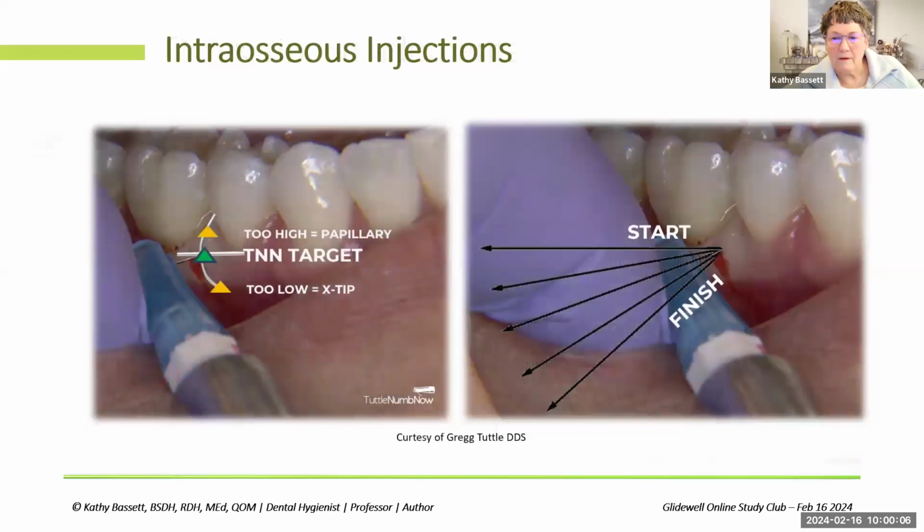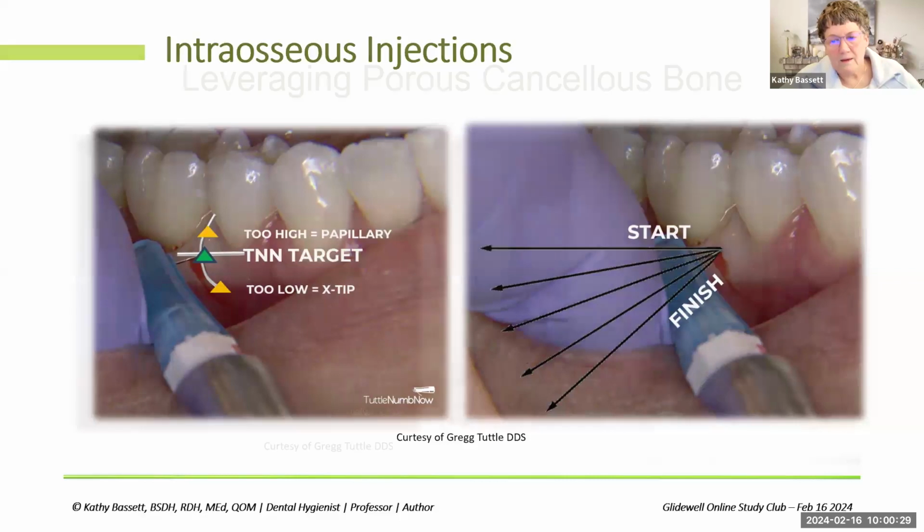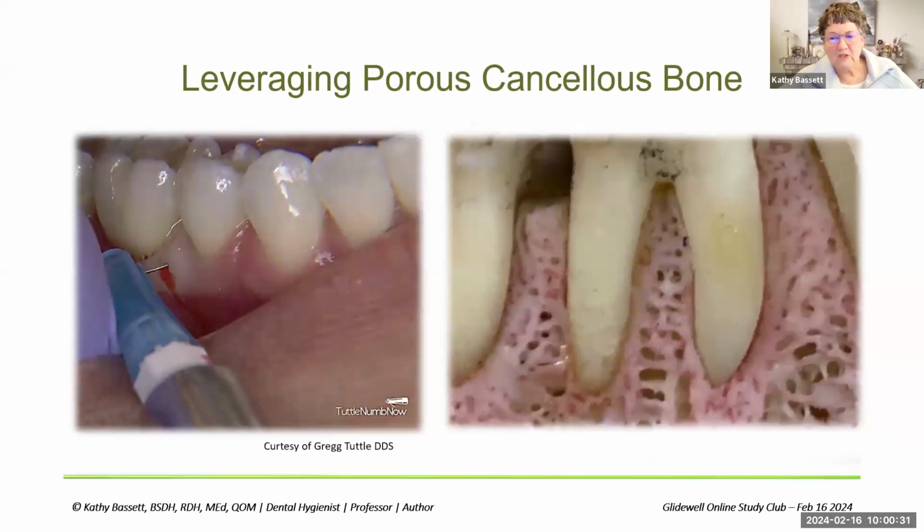The other way that many of you are very likely, when you do implant work, is to be prepared to do an intraosseous if you need to. Traditionally, these require some additional device to accomplish this. However, we can also accomplish this manually with a technique that is being pioneered and discussed by Dr. Greg Tuttle in Utah. And I've had the opportunity to do these both in a cadaver lab situation and clinically, as well as receive one. And it really is quite easy to do.